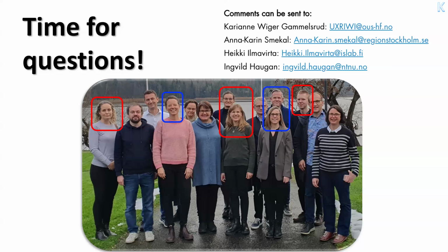Barbara. Yeah, just a comment on these comments. I think that is very complicated, and it really is about what you know in your local lab, what kind of contact you have with your clinicians, and how the communication is done. For example, for blood isolates, you usually have a direct communication, and then you would do things differently than if you don't. So this is really about individualizing how you can use comments.